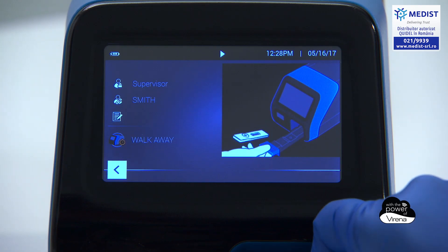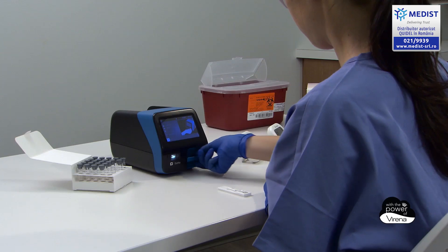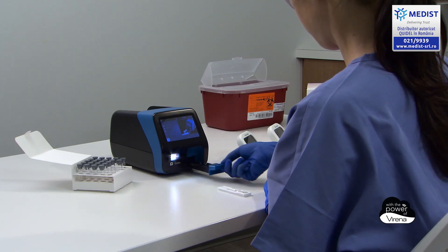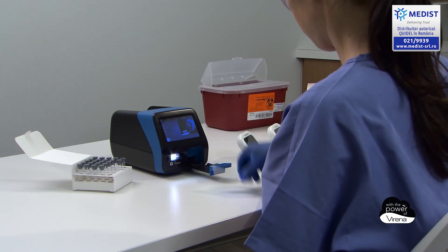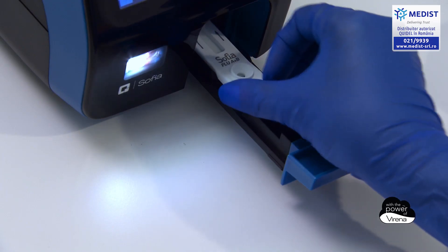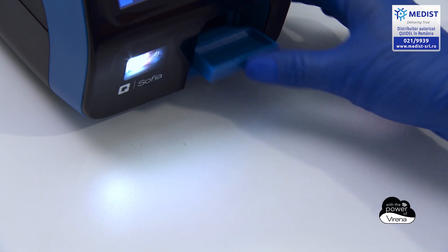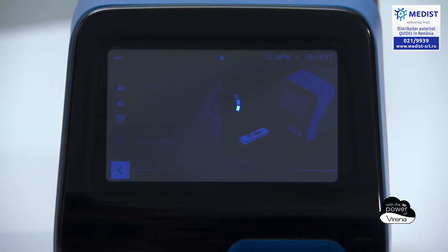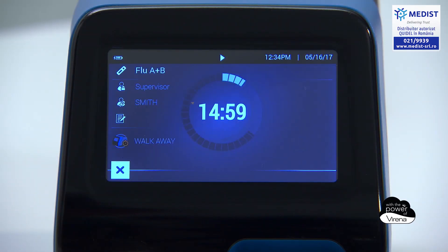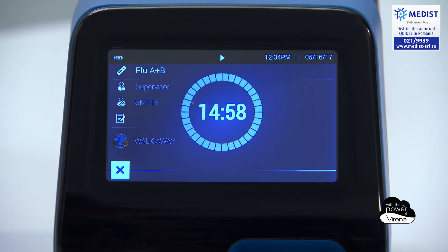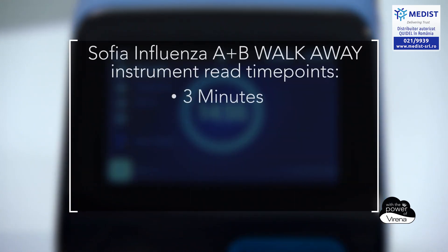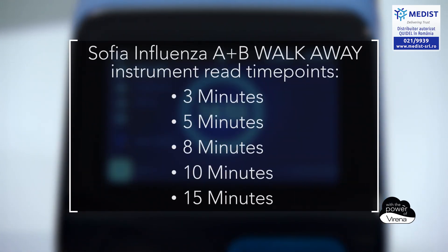The user will then see an on-screen animation instructing to open the cassette drawer and insert the patient sample. Once the drawer is closed, timing will begin automatically. When in walk away mode, Sophia2 will scan the patient cassette at multiple time points during the 15-minute incubation period.